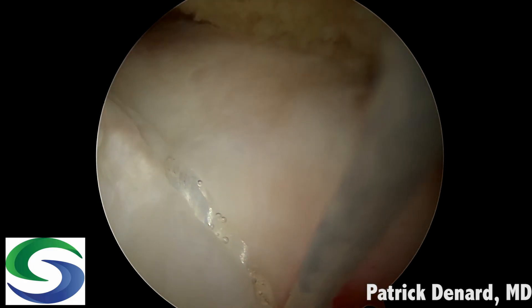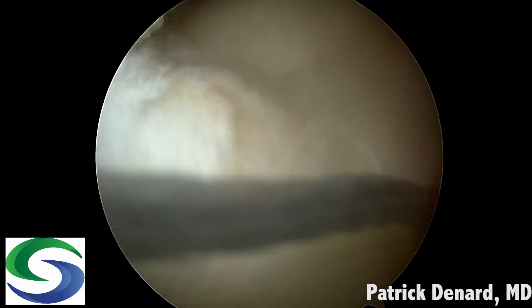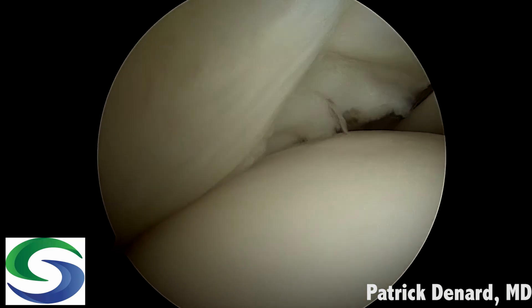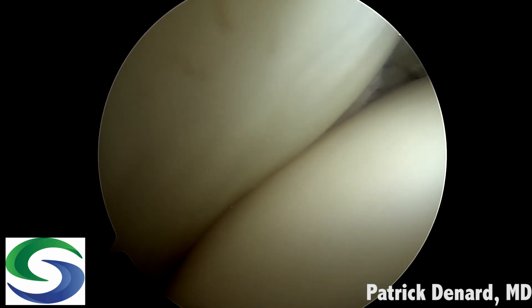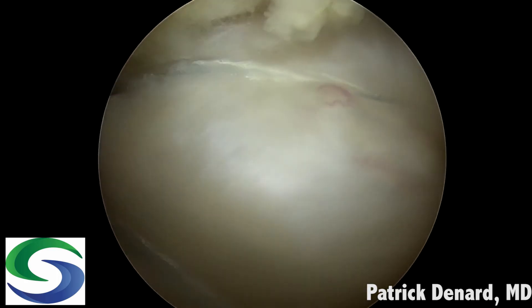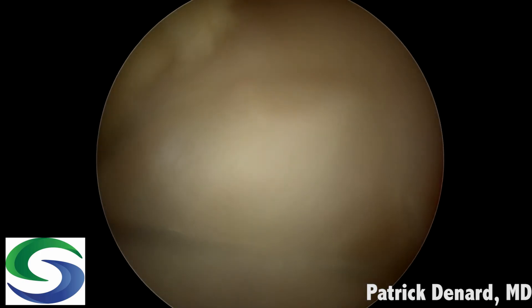This creates a nice bridge between the anterior and medial anchor. As seen on the intra-articular view, it really nicely appositions the rotator cuff to the footprint. We then simply take those sutures out to a lateral anchor as shown before, and there is our knotless double row repair.